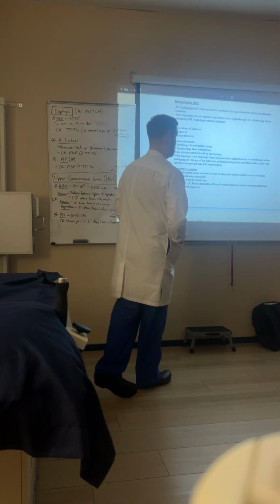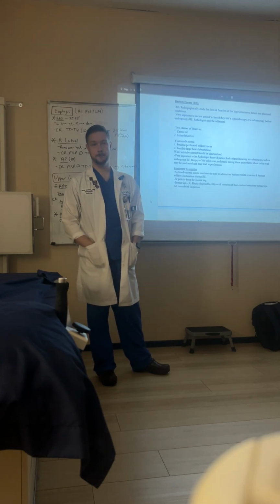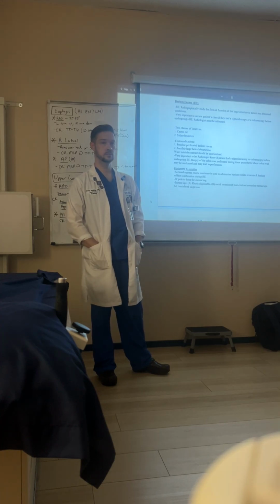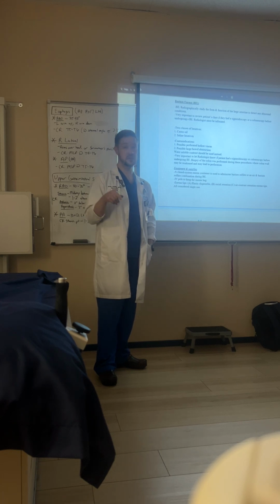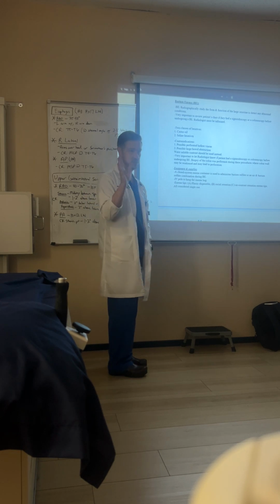Typically your front desk is managing this. They'll schedule, because this is all scheduled. This is typically not a walk-in. In a pediatric environment, a BE can be an emergency thing, but we're not going to talk about that now. For an adult, it's routine.